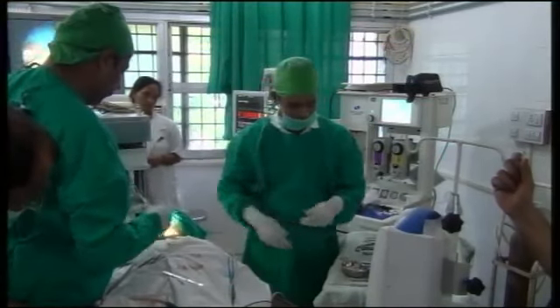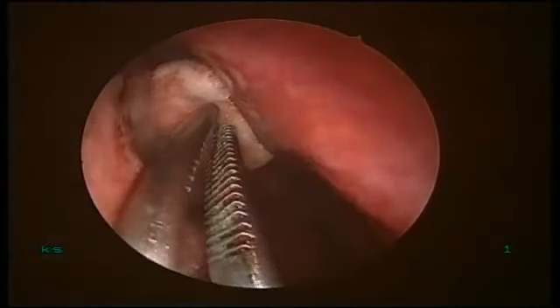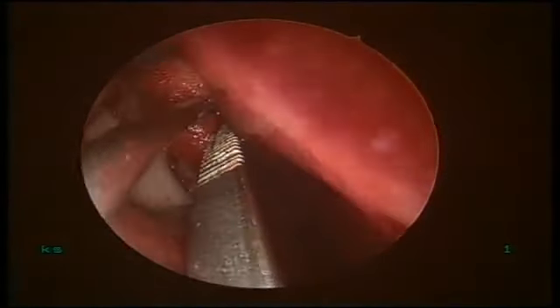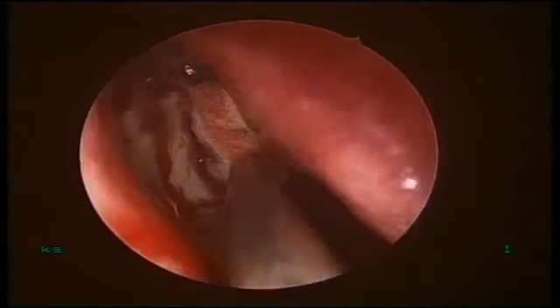Give Merocel. Make this one a third. Identify. Difficult to? Yeah, that's what I'm showing you.